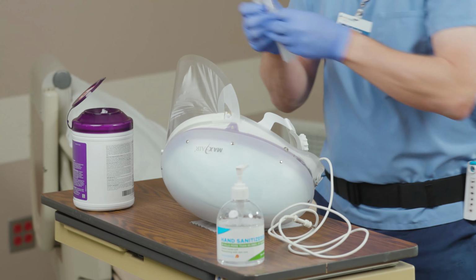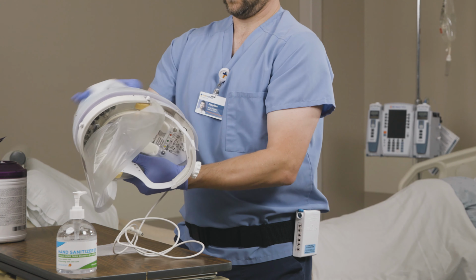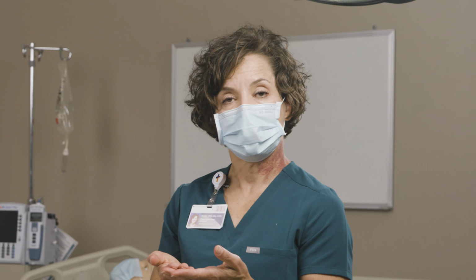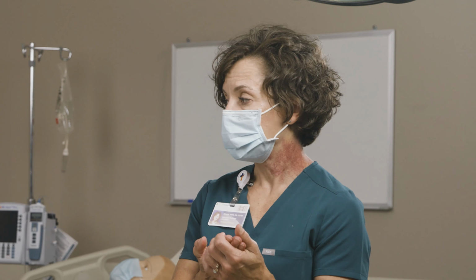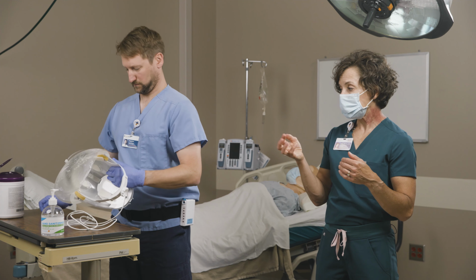And at this point, if you're going to be continuing to reuse your CAPR throughout the rest of your shift, you want to make sure and disinfect the lens cuff while it's attached to the CAPR. And then you can store your CAPR in a plastic bag back in the CAPR cart or whatever designated area you have. If this is the end of your shift, you would remove the lens cuff from the CAPR.